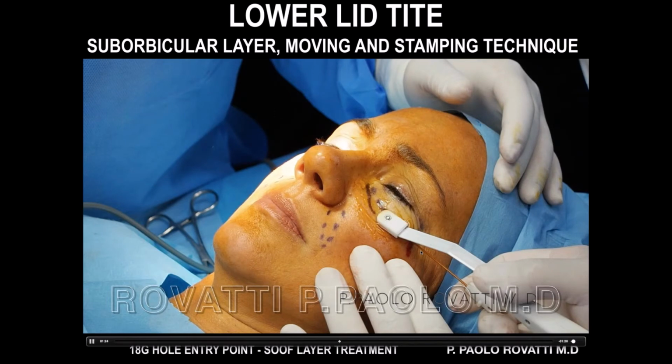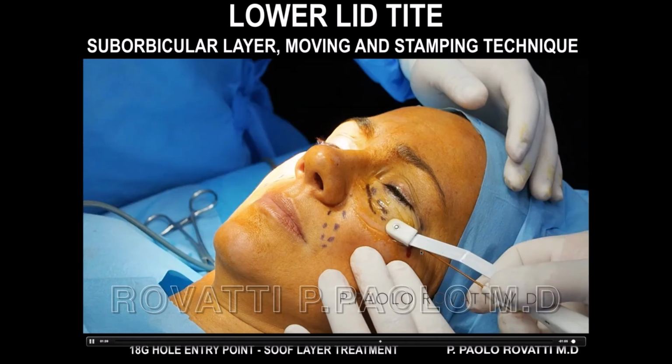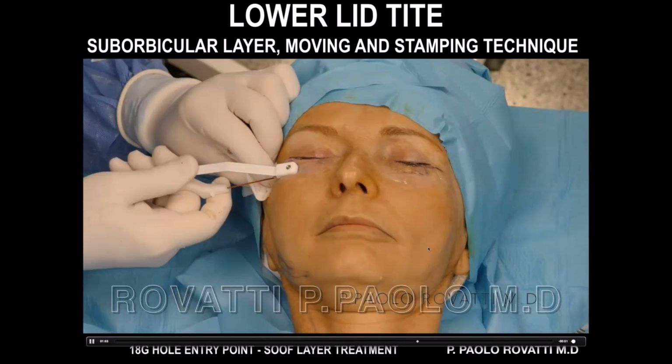After, you can see this video better on the YouTube channel, and I will give you the link. Okay, this is the moving and stamping technique, dual plane, and this is good. Remember, don't go above the orbital rim, and this is what you can have in this kind of treatment.